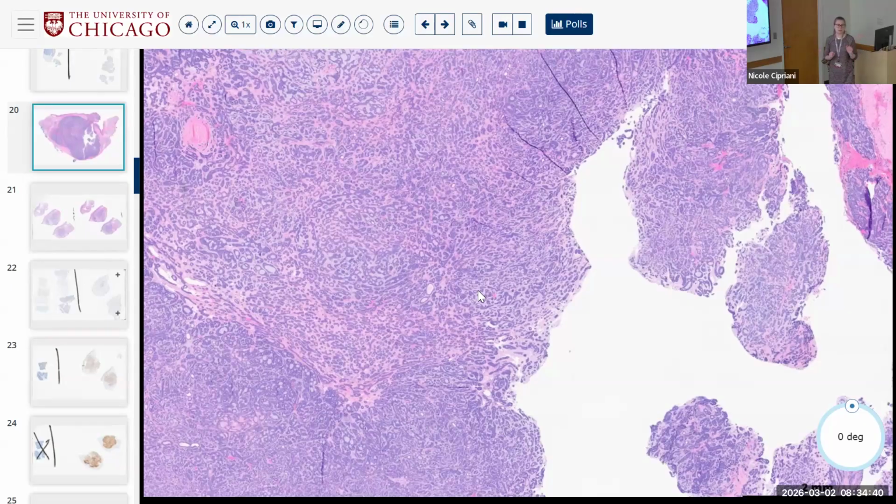There was always an outlier where something low ended up being high. Not so frequently did something high end up being low, right? Because you can see it. But over 90% of the time we were right. So if you think low, if you think high, and if you think basaloid specifically, those three groups are good. And then we test the basaloids. Yes, you will always have an outlier, but the majority of the time, those morphologic features will be right.